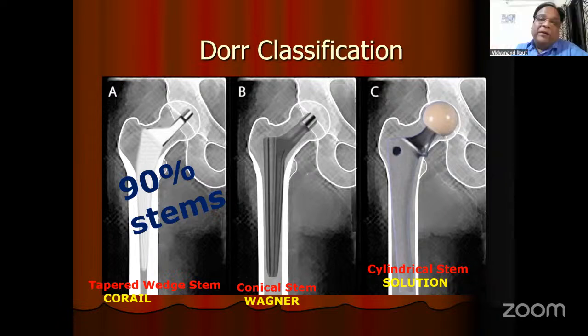Then you go in 1 millimeter increments in the same direction. With the 51 reamer, you find that it's moving but slightly catching, yet once it starts moving, it rotates within the cup. So that's not your ideal size. Then you take 52. When the reamer catches and is not able to move, that is your size.